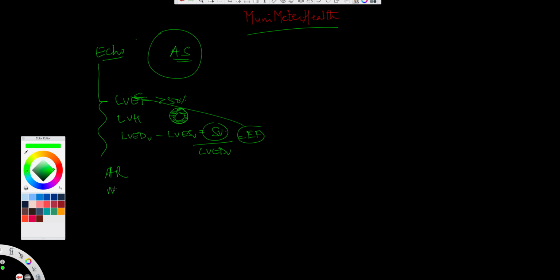You're also looking at the mitral regurgitation and aortic regurgitation, depending upon whether it's mild or severe in category. The way to understand that is briefly in this fashion. If you look at the left ventricle, I'll draw the outflow tract in this fashion. This is just a schematic. The blood flows via the mitral valve into the left ventricle, and as the left ventricle contracts, it sends blood up into the aortic valve and then up into the aorta.